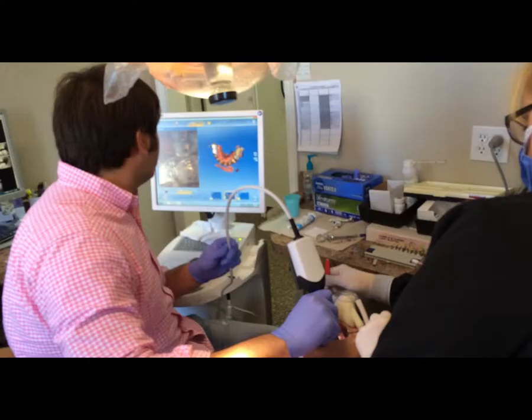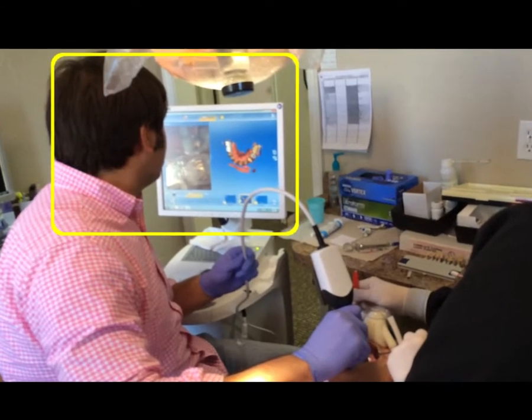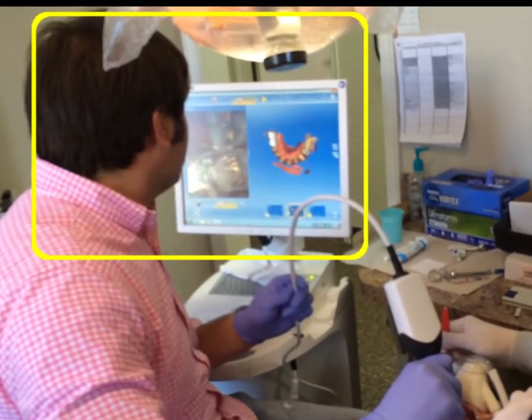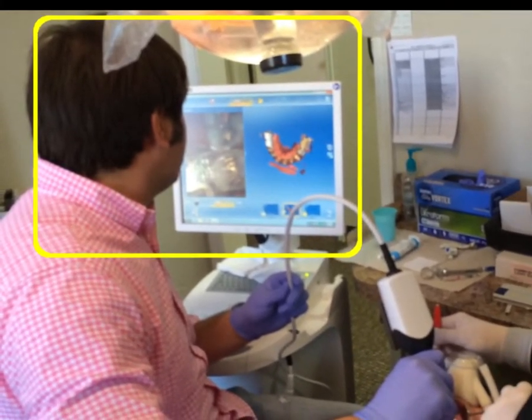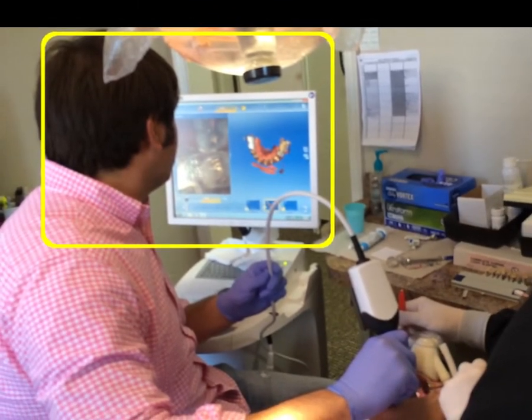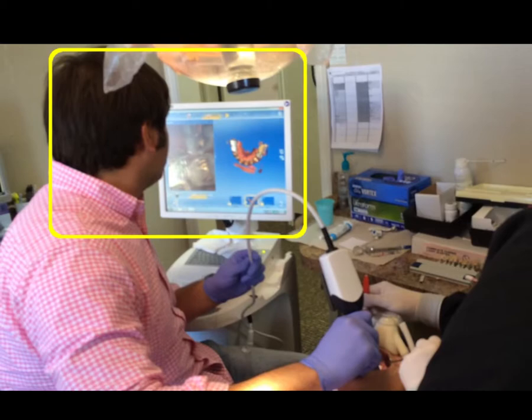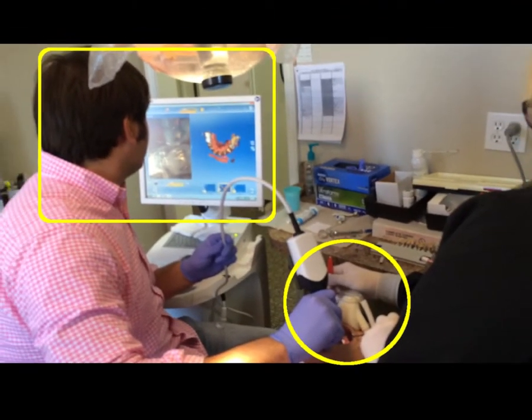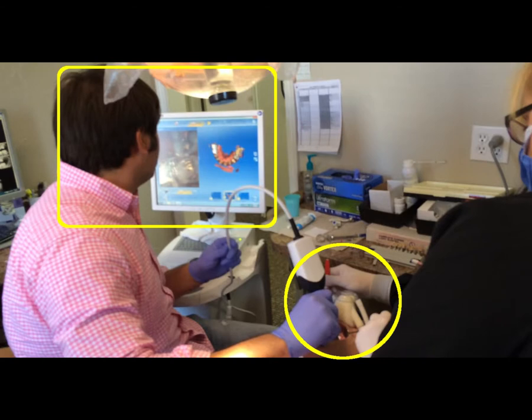In this next segment we are going to observe a technician scanning a live patient to demonstrate how to position yourself while scanning. As best practice, notice how the technician has positioned himself to be focused on the screen, where he can see the camera view and the images being captured at all times. We will now observe how the technician holds the wand inside the patient's mouth and how he moves it fluidly over the patient's teeth to acquire the information needed to produce a proper impression for the scan.